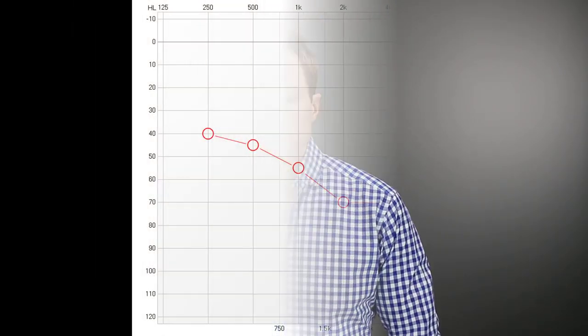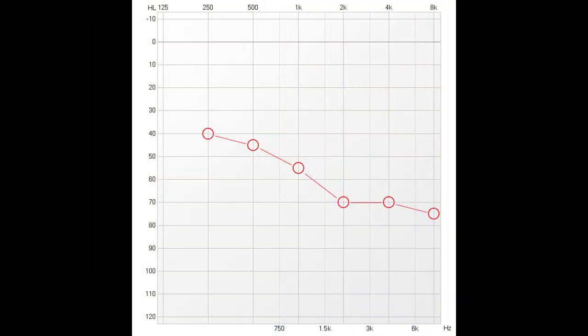Take a look at this hearing test. The O's on this hearing test indicate the softest beep that this person can hear at each frequency tested. The lower these O's are on the graph, the worse their hearing is. If the person being tested while wearing hearing aids could hear these same beeps at a lower level — as illustrated by the S's on the graph — it would indicate that the hearing aids are providing adequate amplification. However, this type of verification is only useful to determine the softest sound a patient can hear while wearing hearing aids, and does not mean the hearing aids are programmed correctly, for four main reasons.